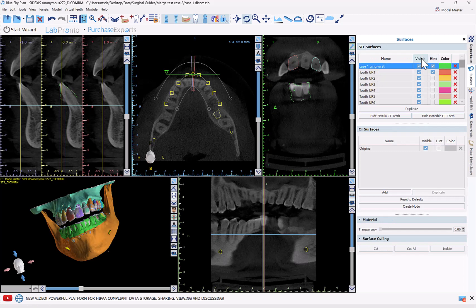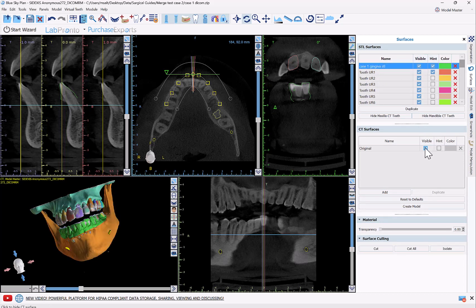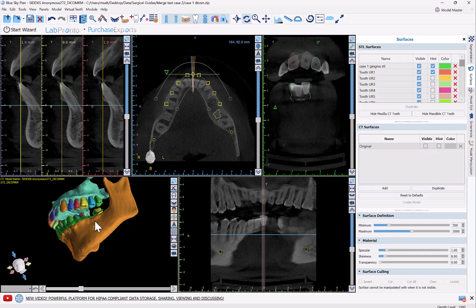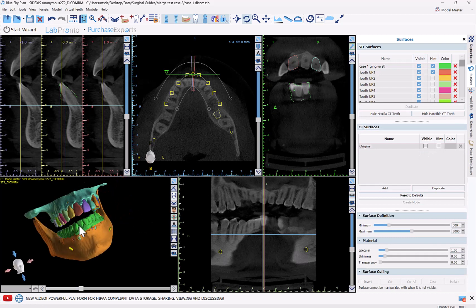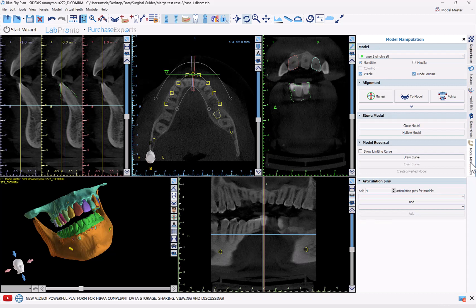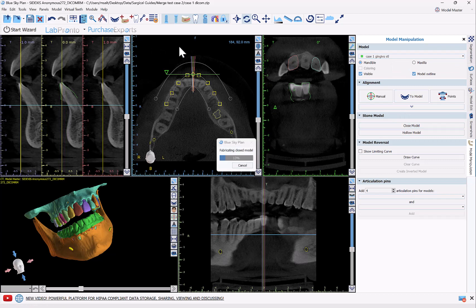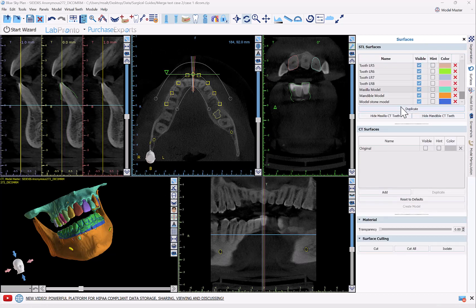Once that's done, we can see that we now have everything segmented. We have our model imported. So I'm going to go over to the model manipulation panel, make sure the correct model is selected, and then click 'Close Model.' Now I have our new model in the CT surfaces list, so I'll just call this 'Closed Model.'